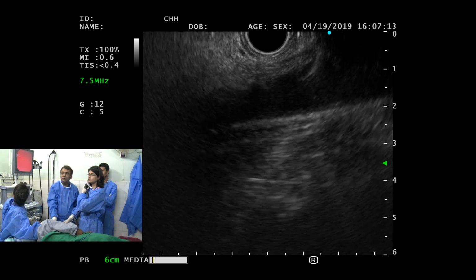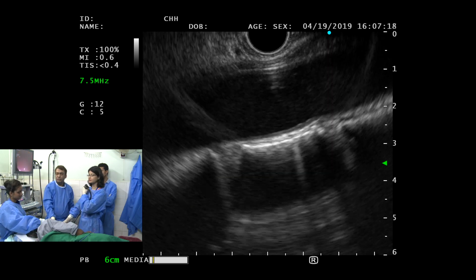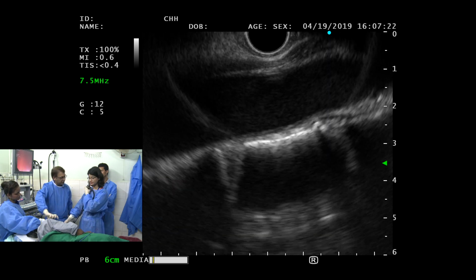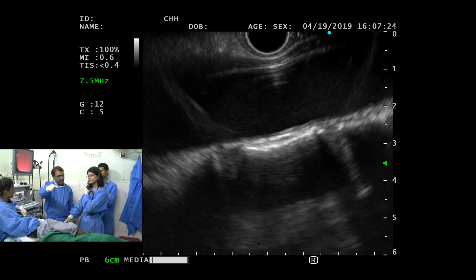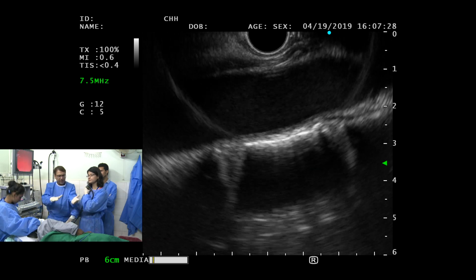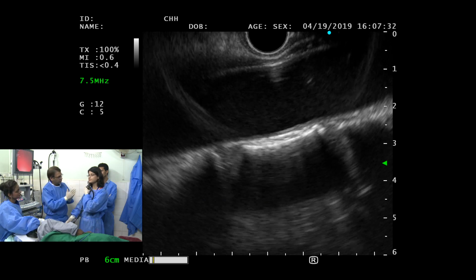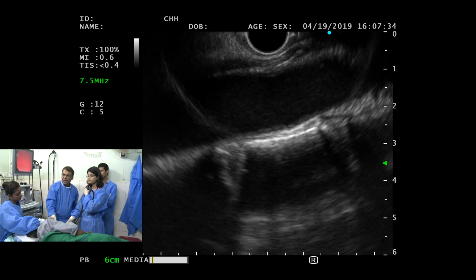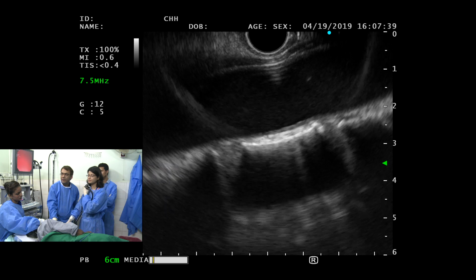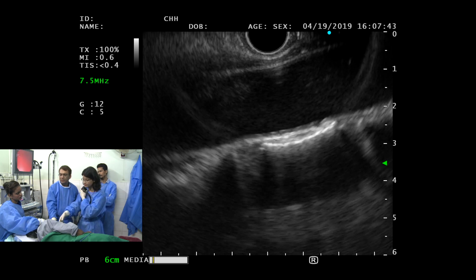Okay, so when you get to that, so Khalid, at this moment I have come, so the aorta came. Yes, like a little bit, your movement, the whole movement you were doing here, was not being transmitted. So that needs to be transmitted. That's just this movement, okay? If it fully transmits towards the end of the transducer, you won't have to do that much. Okay? So that will come with the experience. So it's not a problem. Okay? Now when you get the aorta, okay? So gently. If I have to push the scope further, do I have to come closer to the patient?